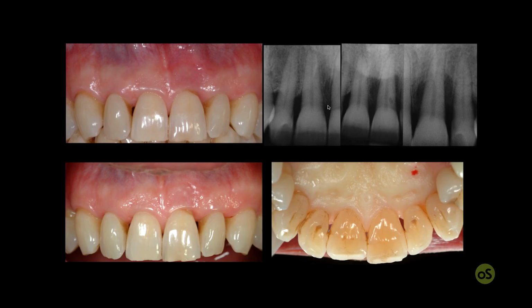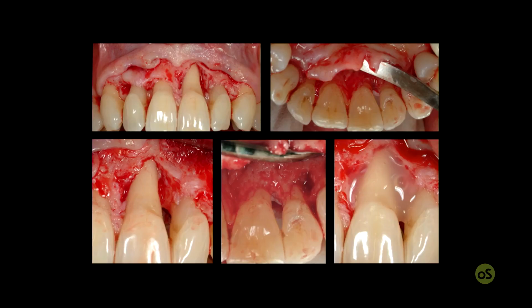The 2 central incisors. The bone is perfect. Here, you have a completely healthy situation. Here, distal, between the lateral and the canine, completely healthy. So we make an envelope type of flap, and of 1, 2, 3, 4, 5 papillae. This is healthy, so it is de-epithelialized. This is healthy, so it is de-epithelialized. This is healthy, so it is de-epithelialized. This is a defect. This is a double defect. And so this is elevated.